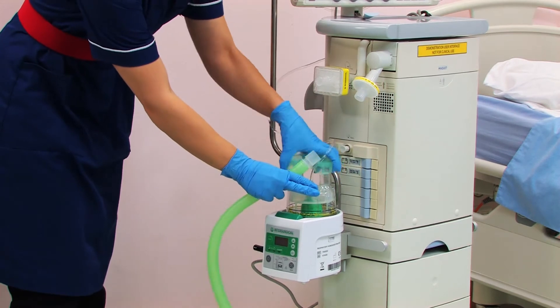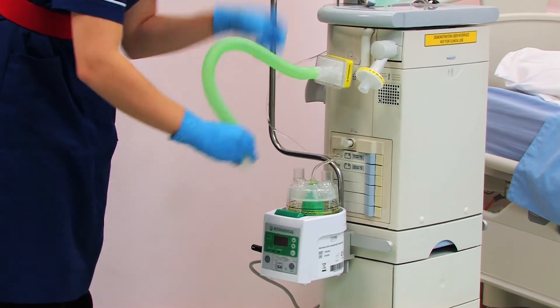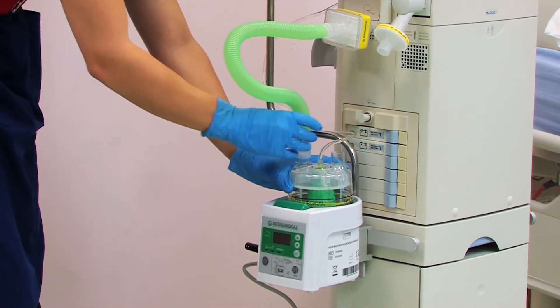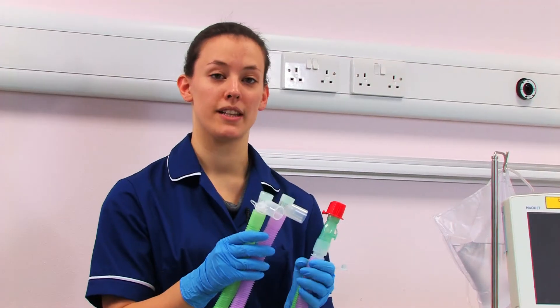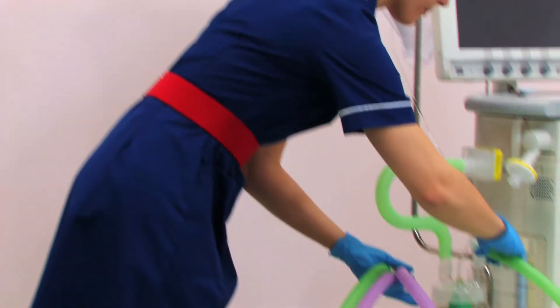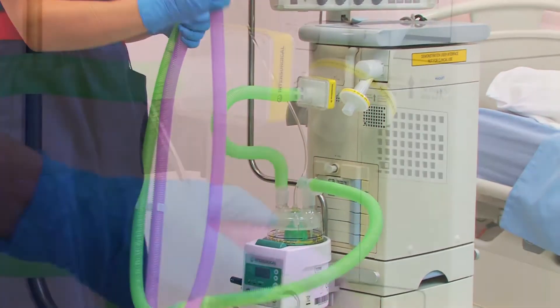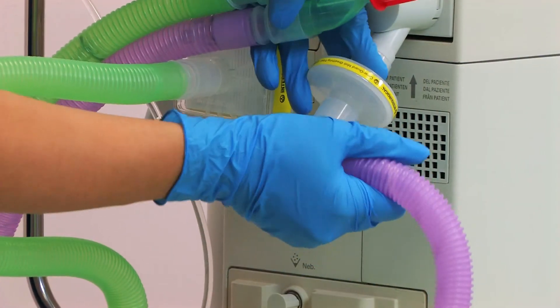Remove the cover and attach the short inspiratory limb. Connect the breathing system. The connector with the temperature port goes on the chamber. The expiratory limb goes on the ventilator.